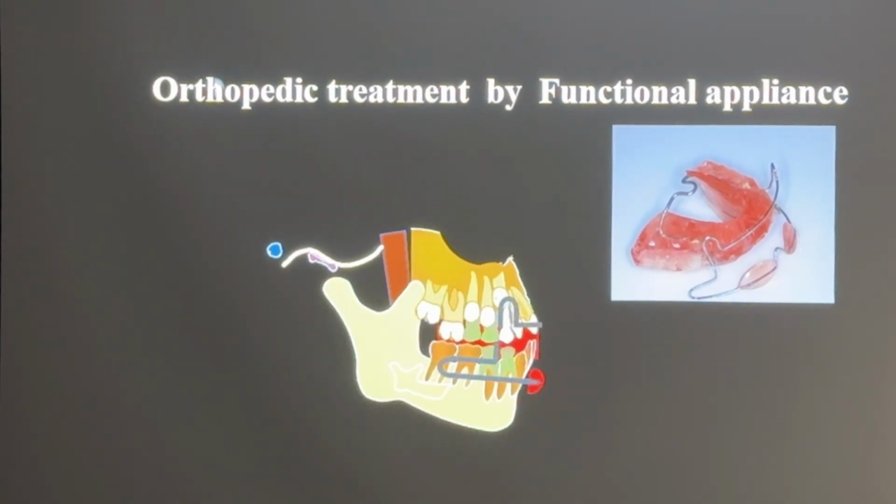Okay, let's review my appliance again. The lip screen is more major, and a little wide and thin. So don't make it thick.